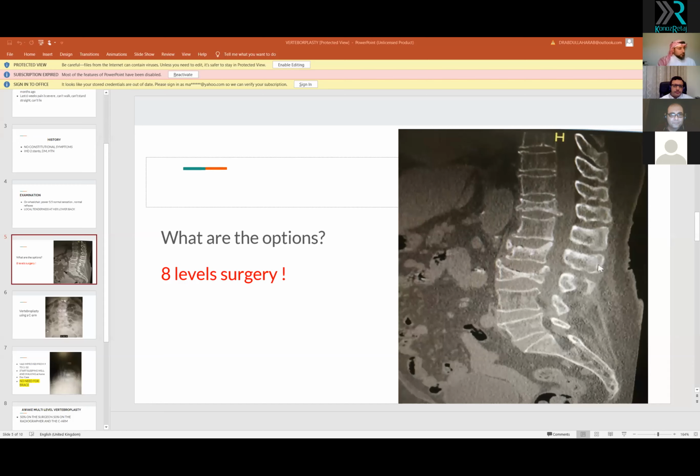And awake multilevel vertebroplasty always needs to be a speedy procedure. The patient will be in a prone position, awake, and they will start having breathing problems. Pain during the procedure has to be well covered by local anesthesia, and if you can have an anesthetist with you to give some sedation.